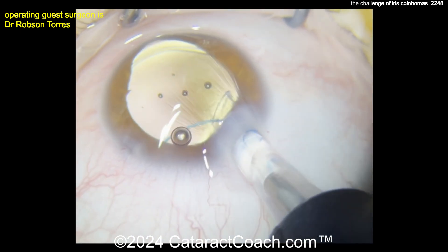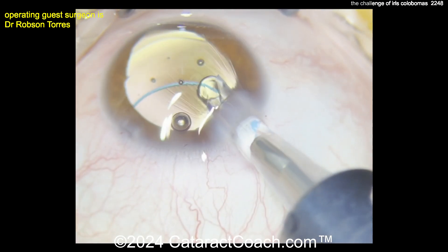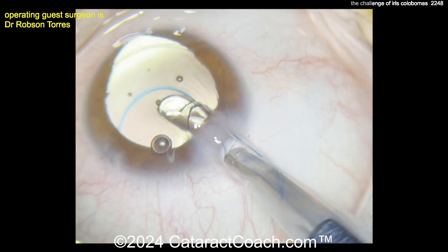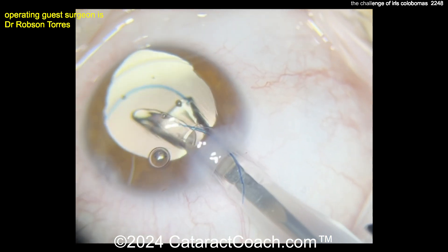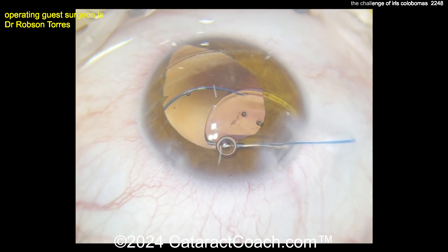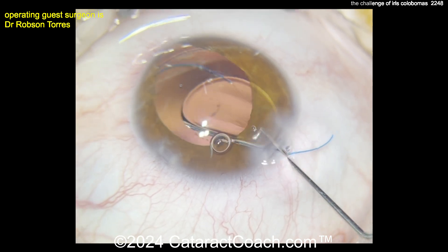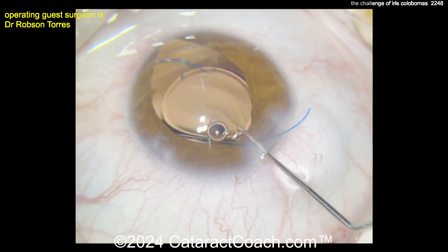Remember the 7L rule: the leading haptic should look like the number 7 — that's the correct orientation. The trailing haptic should look like the capital letter L. So the lens is in an anti-S configuration, not an S. As we say, S is stupid, and we don't want to make a stupid mistake.